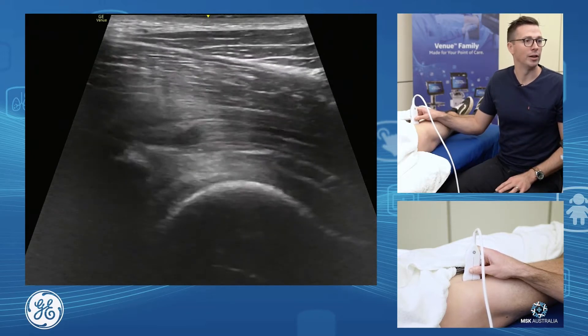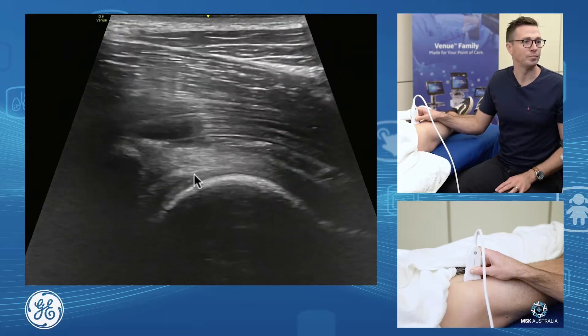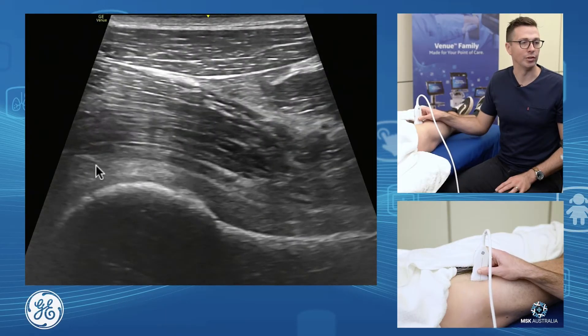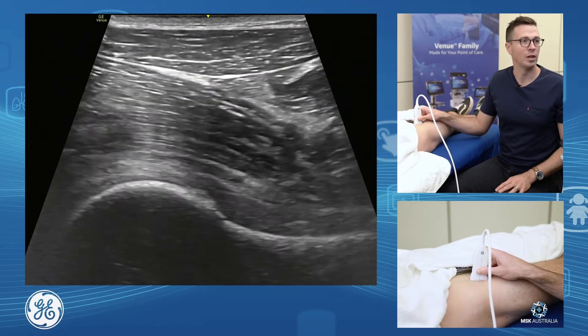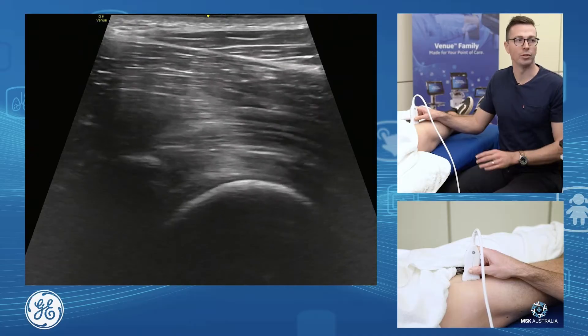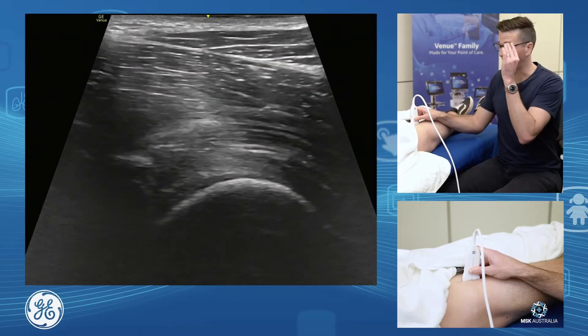We can have a limited assessment of the anterior labrum and the joint itself. From here, what we're going to do is assess our iliopsoas complex.